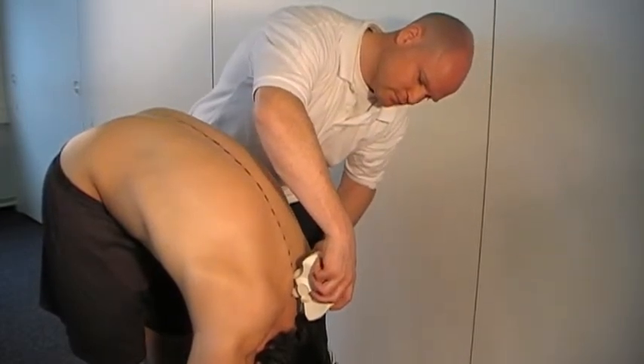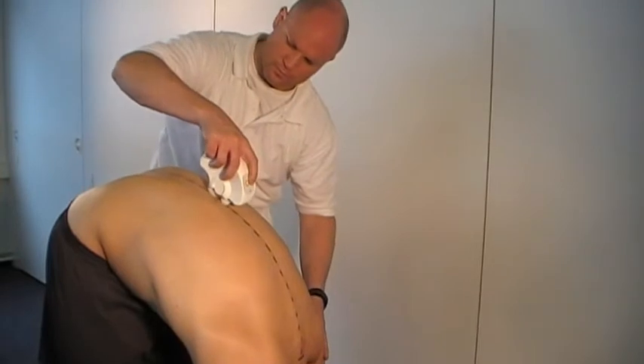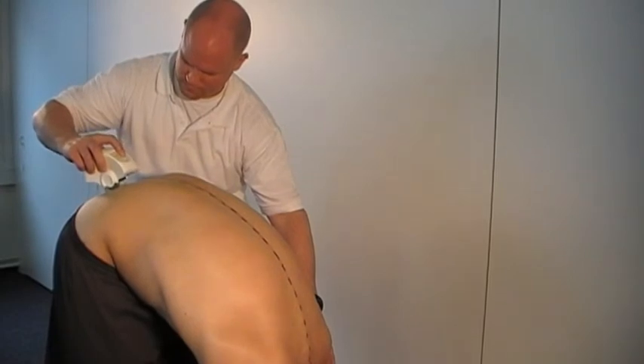An easy way to record uniformly is when you position yourself on one side of the patient. Guide the spinal mouse along the spinous processes. You can find a detailed measurements procedure in the application video recording data.